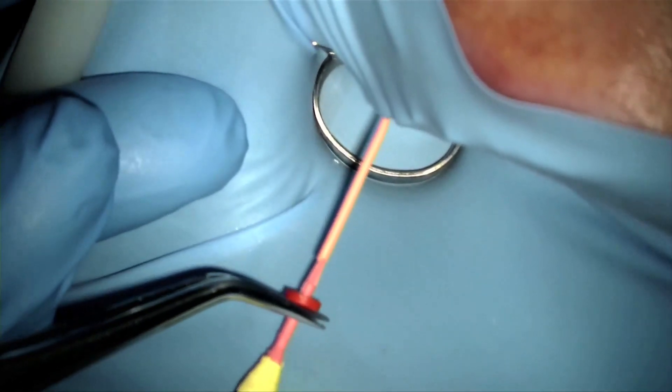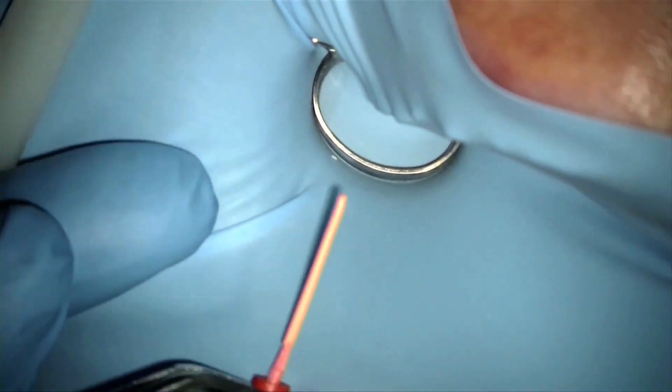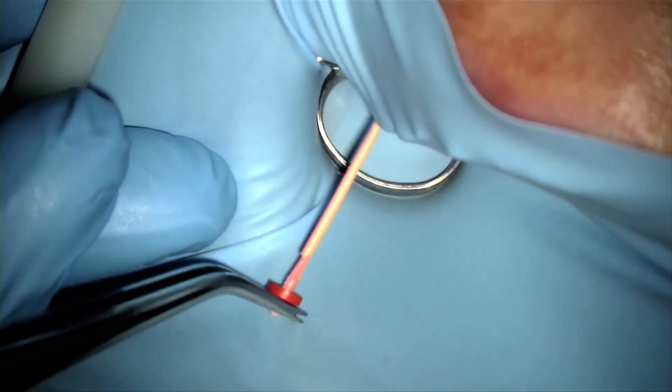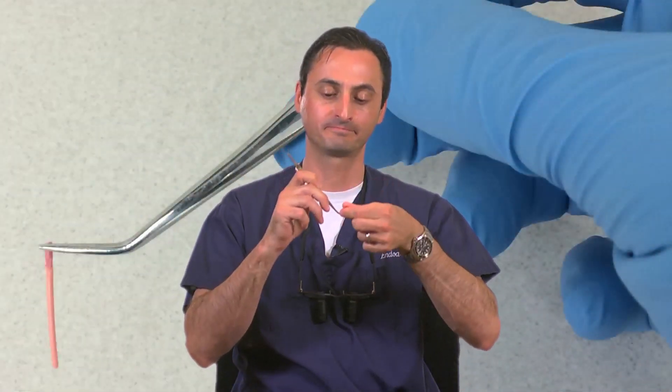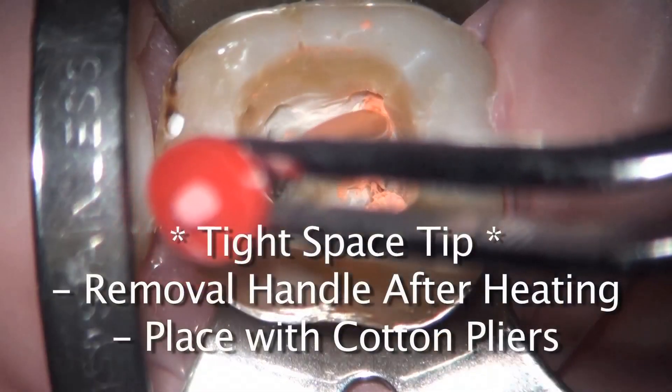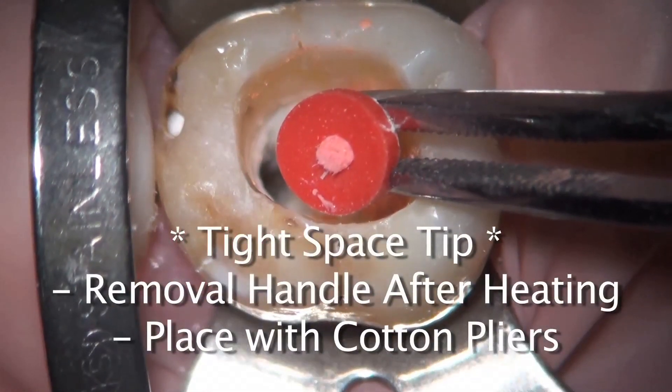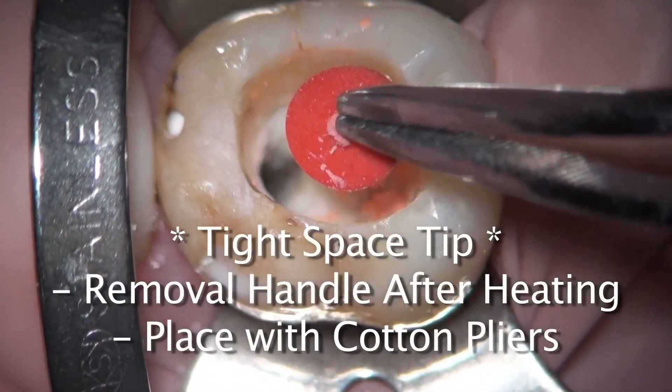As you can see in the clinical demonstration, only the gutta core obturators can make warm 3D obturation so easy in difficult-to-reach sites. The ability to break off the gutta core handle and turn the obturator into a shorter, easily maneuverable instrument separates this from other warm obturation systems on the market. Many obturation systems may enable you to obturate with warm gutta percha, but please ask yourself if they can be used easily, predictably, and comfortably in more difficult-to-reach sites.